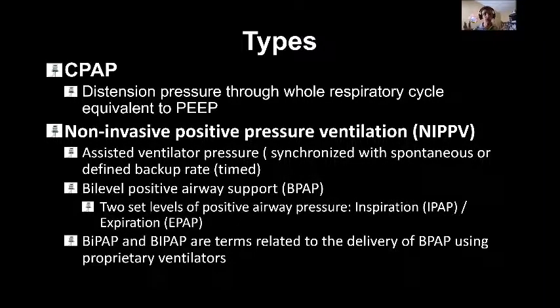What is synchronizing? Remember, when we ventilate, you have two types of breaths. First is mandatory, which is the breath that the ventilator provides, and second is spontaneous, what the patient is doing. When you match the mandatory breath provided by the ventilator with the spontaneous breath done by the patient, we call it synchronized.